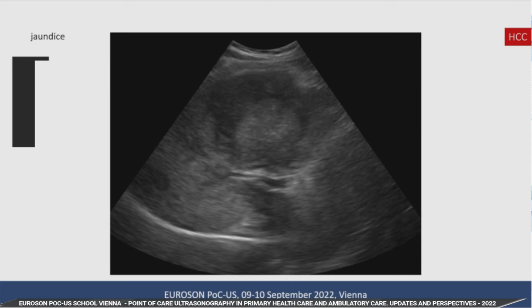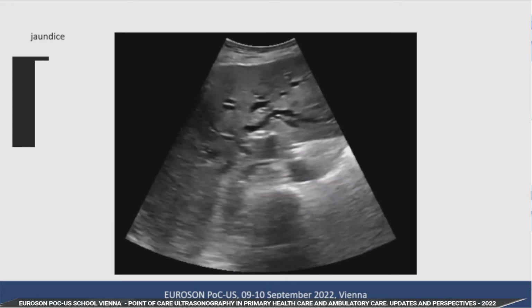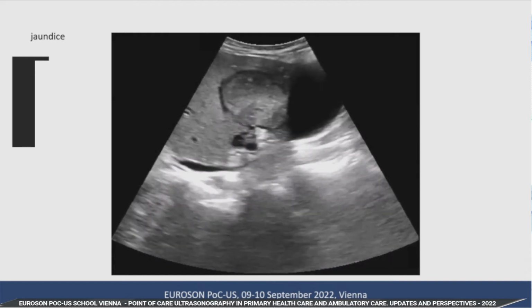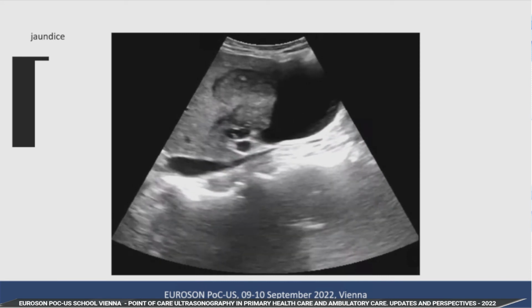Well, another patient is coming to us also with jaundice. We see the dilatation of the biliary tract. We can see the gallbladder and the tumor in the gallbladder. It was gallbladder cancer, which was pushing on the biliary tree, causing the jaundice.